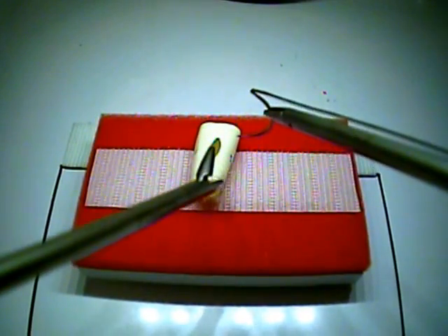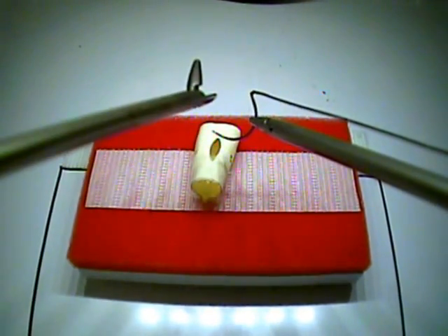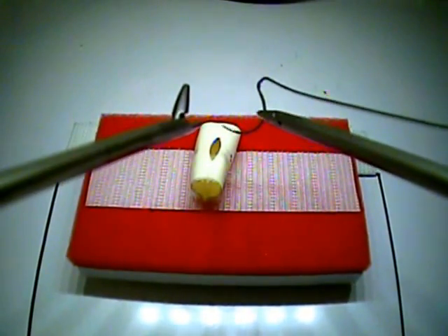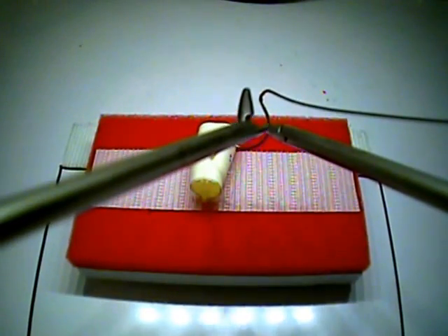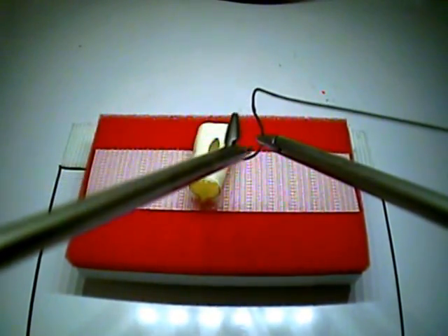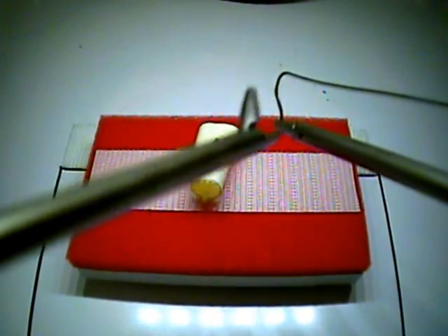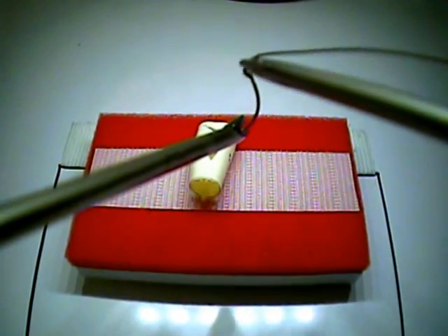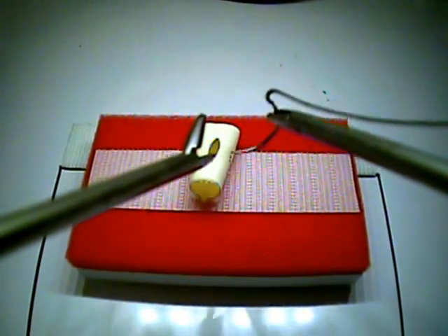In order to set up the needle for an extracorporeal suture, the suture must be introduced into the box with the dominant hand — in this case the right — which is the side that will be doing the tying once the suture is removed again from the box. The suture must be introduced with the same hand at which it is withdrawn for the knot to be thrown. We recommend that outside the box, you set the suture and needle into the needle driver's jaws on the right side, so that the needle is pointed in the appropriate direction once introduced into the box. Transferring it to the left and back to the right to throw the needle is much more efficient if the needle is pointed in the appropriate direction already.